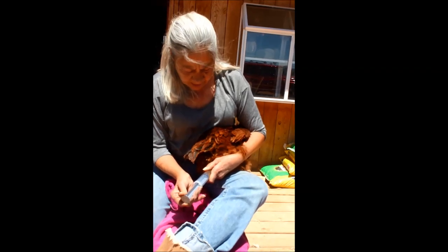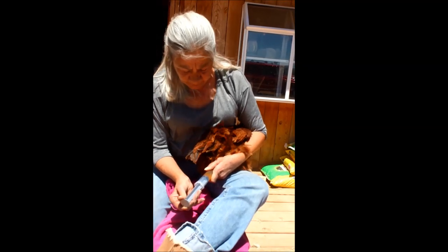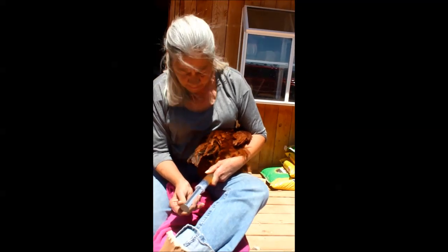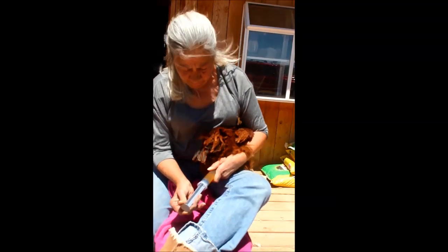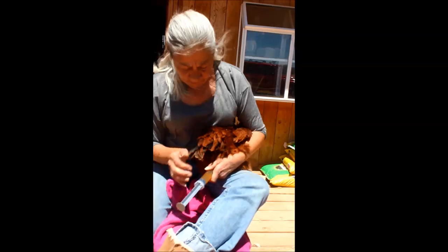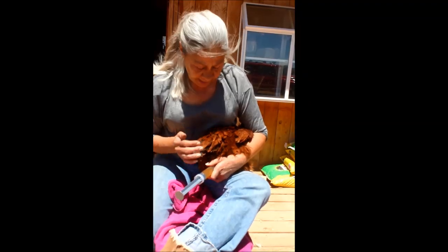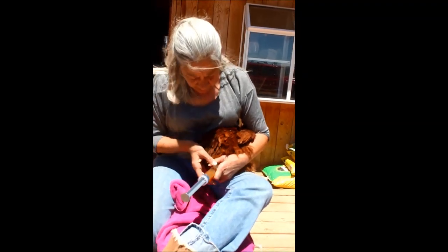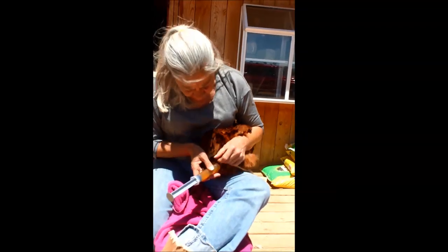You notice she's not kicking or flailing. She's pretty calm about it. Now we're at 60 ml, and I know there's a lot more than that in there. So what I'm going to do is disconnect my syringe, leaving the needle inside her.